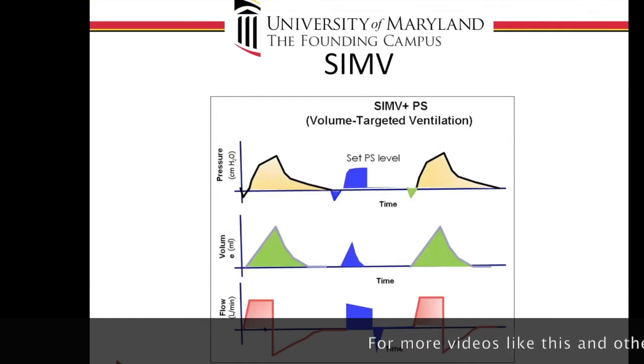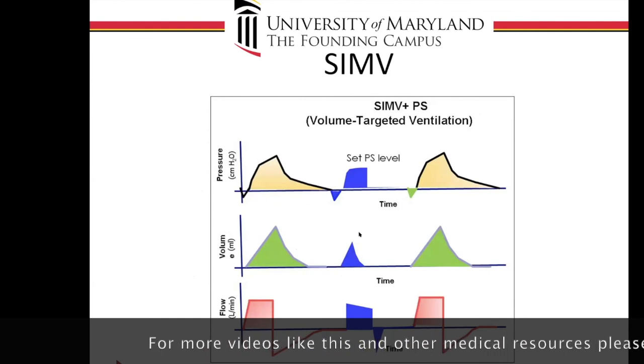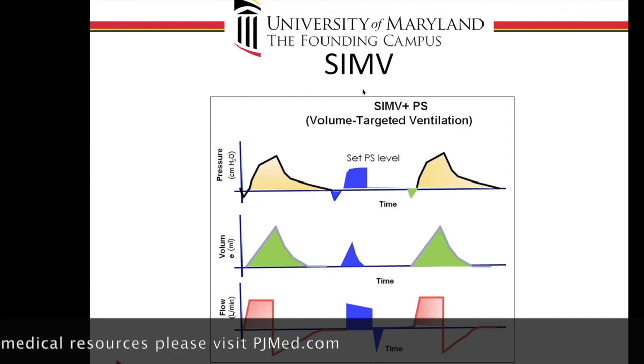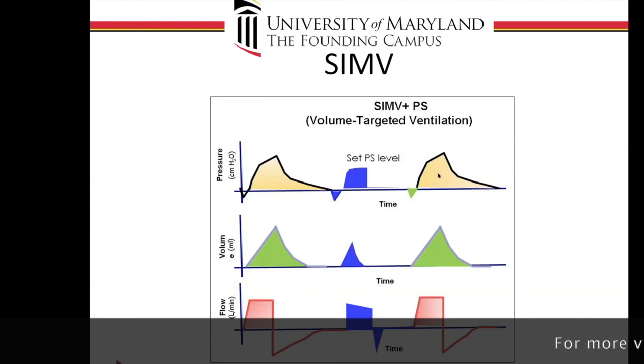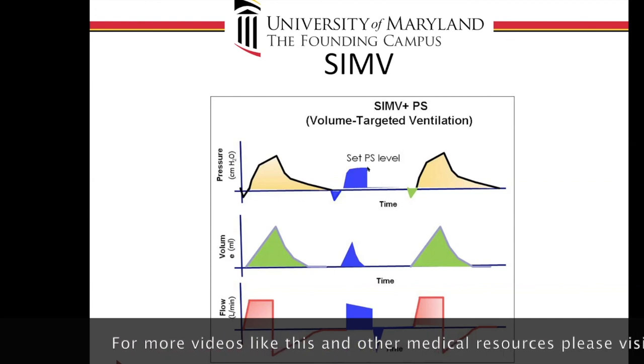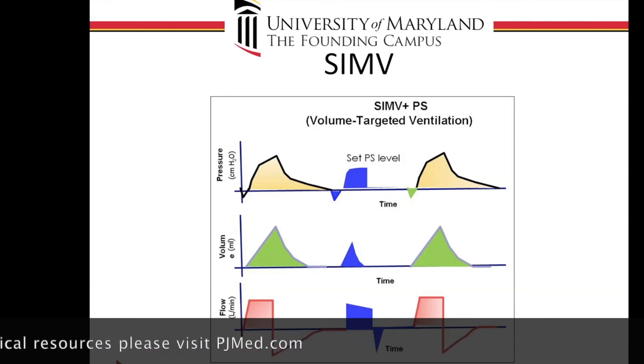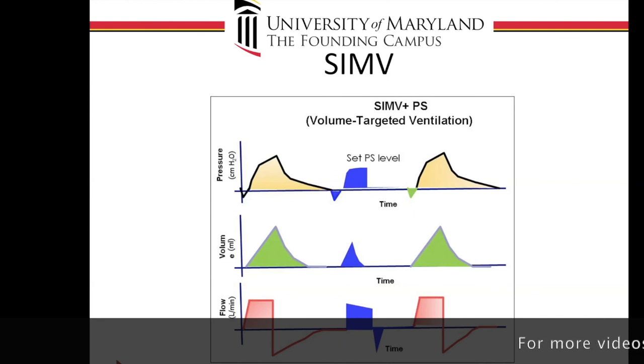See that waveform? Very similar to assist control. The only difference is now in between breaths, we have our mandatory breaths, that's the MV in this mode, but intermittently, the patient may say, hey, I want to take a breath, but I'm not due for one for a couple more seconds. Okay, we'll let you take a breath. We'll give you some pressure support. For those of you who have flown an aircraft, this is like your combat edge, your mask that you wear in the aircraft. For those of you who have done your high altitude stuff, you know what positive pressure feels like, right? That's the same concept here. That's exactly what it feels like too, by the way, on the mask.